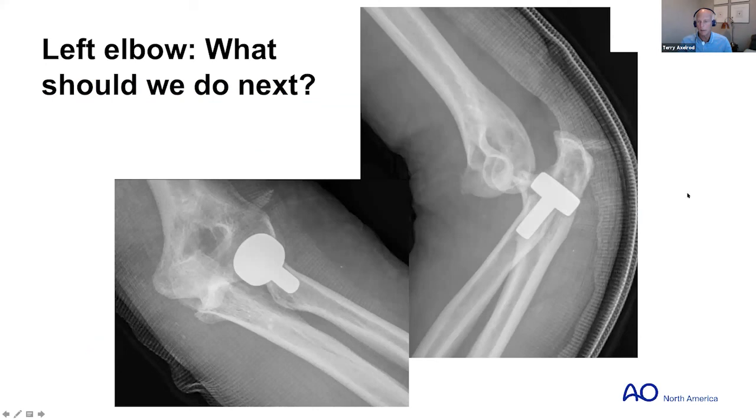This is our psychiatric patient, a suicide attempt, and this is now approximately 2 to 3 weeks after the initial surgery. And as both of our faculty mentioned already, it's really important to do a full manipulation and examination under anesthesia, to be sure that they're stable. And this guy was remarkably stable. So what happened in the 2 weeks, I just don't know. But things do tend to swell. The ligaments get a little bit more edematous. I'm not sure. The bad head injury, he pulls the repairs apart, and it goes like this.